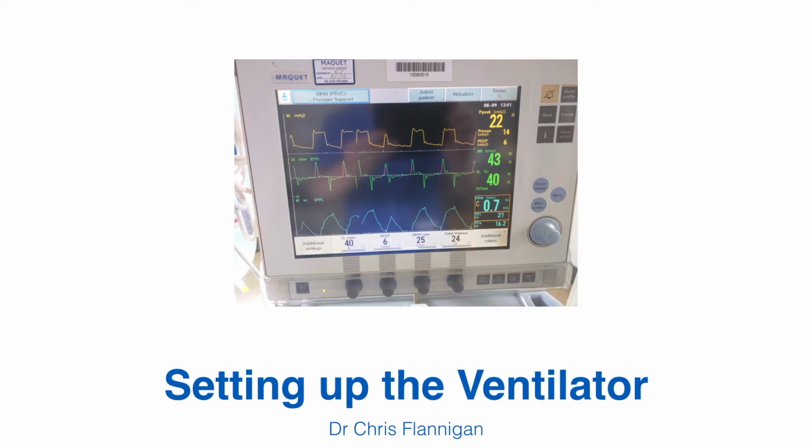When you start to blow the balloon up, it's quite difficult to get the balloon started. You're using quite a lot of pressure to get that initial inflation. But once you've got a little bit of air in the balloon, it's quite easy to blow up the rest of the way, until the balloon starts to become over distended and it gets more difficult again to blow it up. So wouldn't it be great if the balloon could be kept slightly inflated, so you've already overcome that little bit of difficulty from blowing it up?